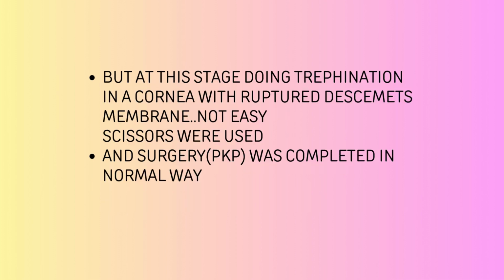But at this stage, doing trephination in a cornea with ruptured Descemet's membrane is not easy. Maybe he has used scissors, again used trephination, and he completed his surgery in the normal way. This is one scenario.